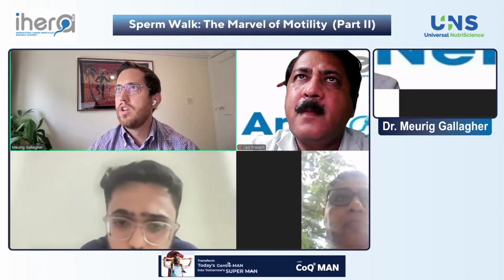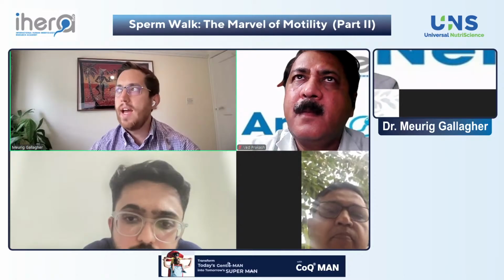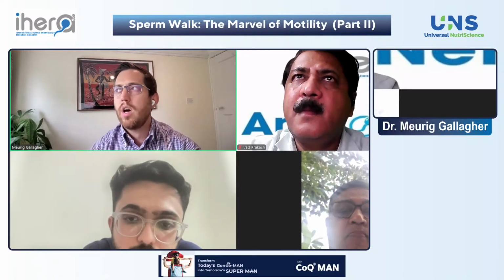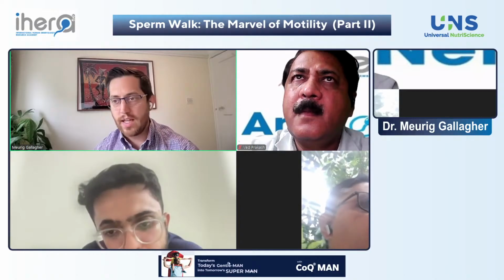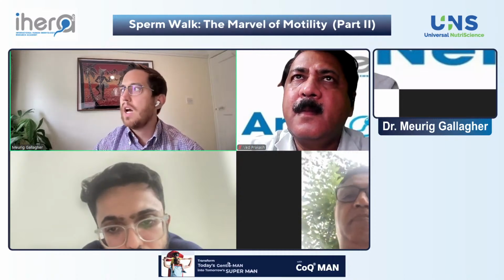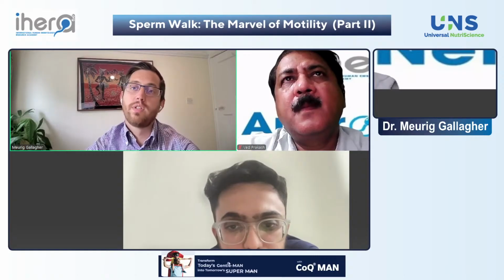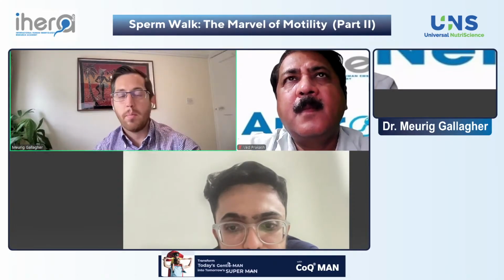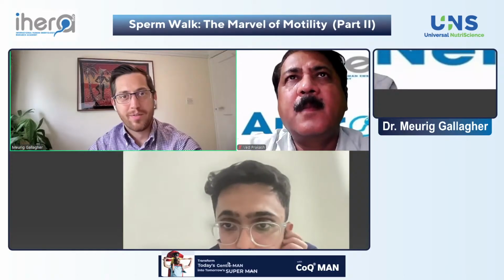We've done some studies looking at flagellar waveform parameters and DNA integrity, measured by TUNEL, I should say, and we haven't shown any great correlations. But I think this goes back to the idea that a lot of these measurements aren't particularly useful in and of themselves, and are actually measuring something slightly different, and it's useful having multiple measurements of the same thing. In the Hub-Select trial we did multiple DNA fragmentation tests, TUNEL, comet, halo, and acridine orange, on the same samples, and we showed all of them are measuring slightly different things because none of them correlate with each other either. So there are a lot of open questions there that I think remain to be answered.